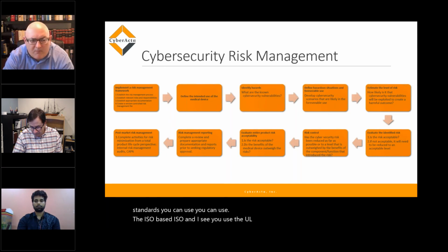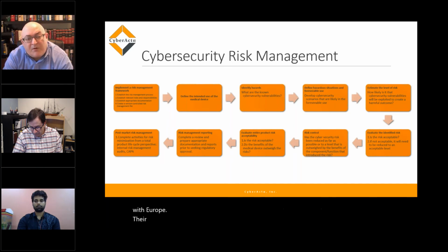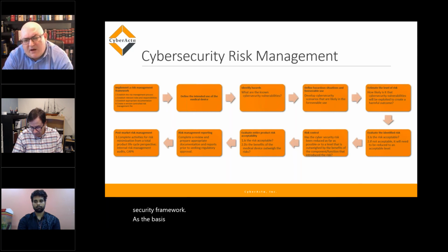The FDA, again, I want to remind folks, with Europe, depending upon the country, from a testing standpoint, they're leaning more towards ISO and IEC. From an FDA standpoint, what they're looking for is the NIST cybersecurity framework as the basis for the implementation. In Australia, they have their own cybersecurity framework.